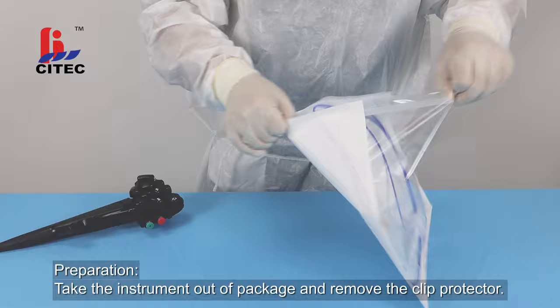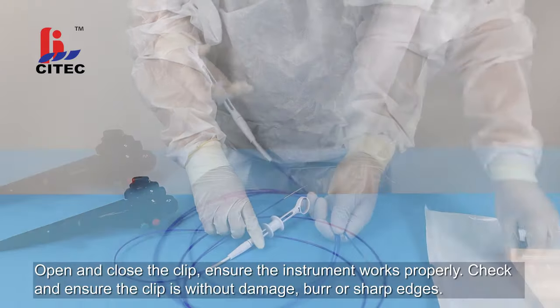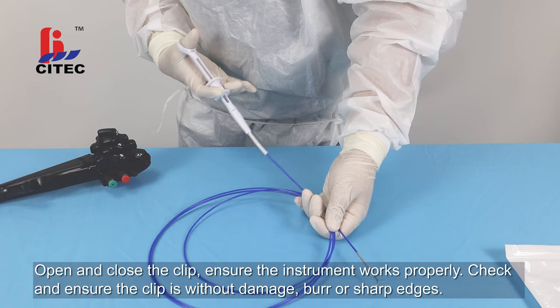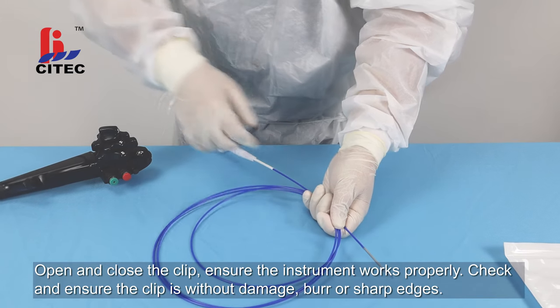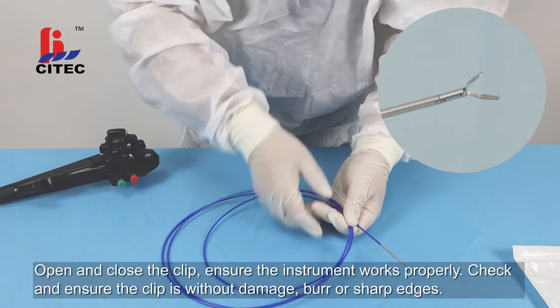Take the instrument out of the package and remove the clip protector. Open and close the clip to ensure the instrument works properly. Check and ensure the clip is without damage, burr, or sharp edges.